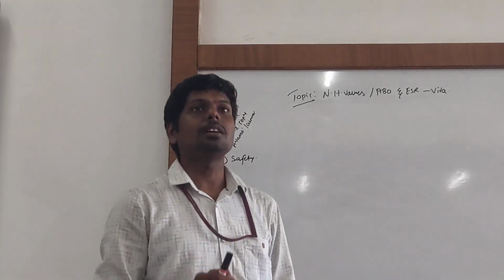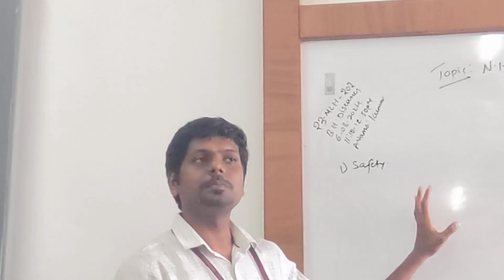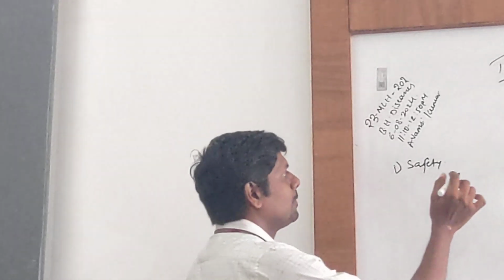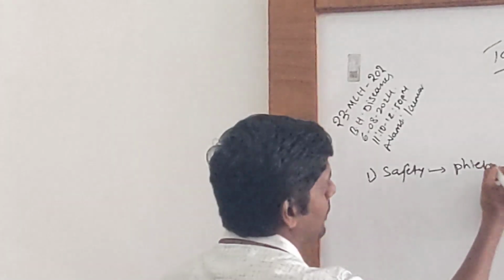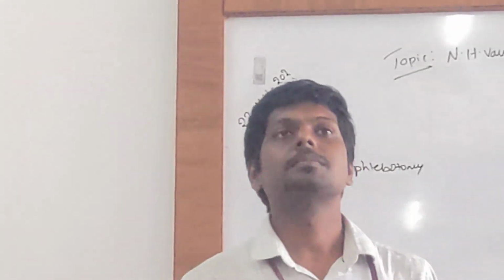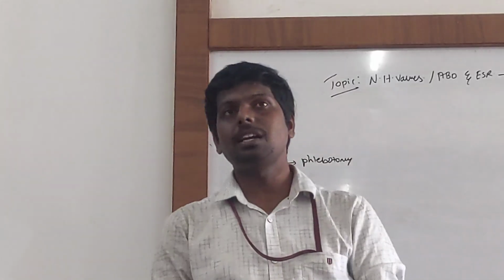So what are the types of troubles we might get in this lab? Let us see. The first thing we are doing will be phlebotomy, right? So what does phlebotomy mean? Yes? Collection of venous blood, right?